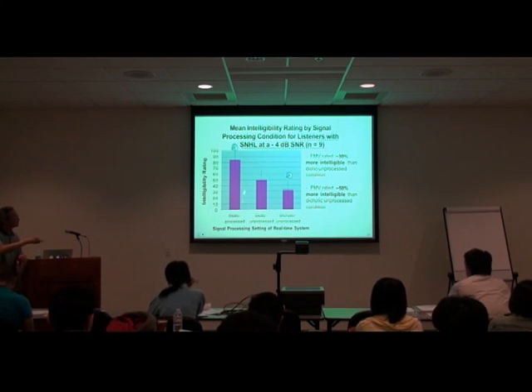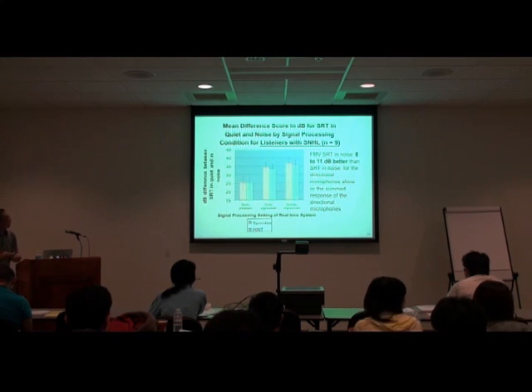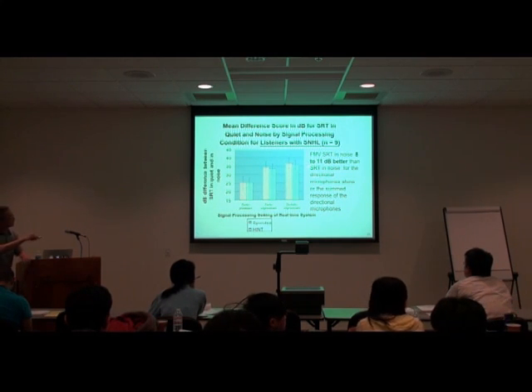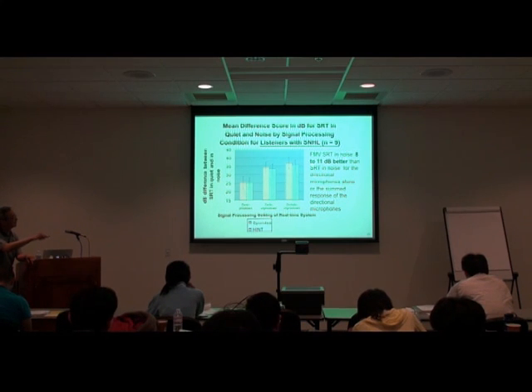The intermediate condition is kind of interesting. It helps a little bit, but not as much as the processing. So this intelligibility really differs by 50%. When you look at the speech reception threshold, again, the lower the better. With the directly processed signal you have a lower threshold, a lower signal level, and by comparison, unprocessed needs a higher signal level. So it's 8 and 11 dB better.